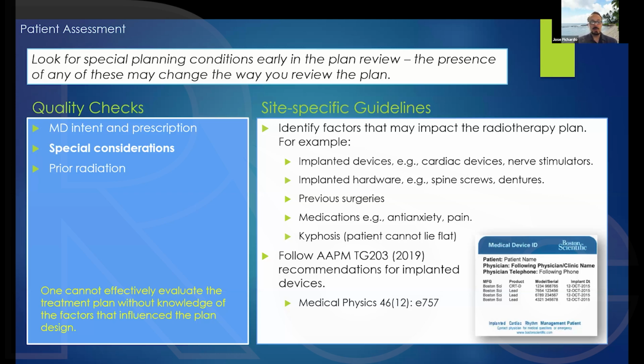If a patient has kyphosis, you're going to have the same issue, right? They cannot lay flat. My recommendation is to always follow the AAPM report TG203, right? And I'm giving you the reference at the bottom here, so you'll have a copy of the presentation, or when you watch the video of the presentation, you can take a screenshot. This is a very good resource document to have.